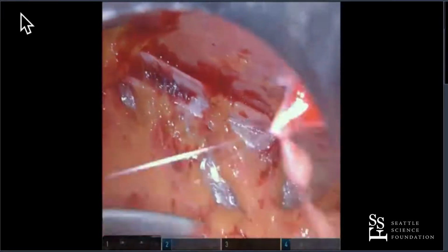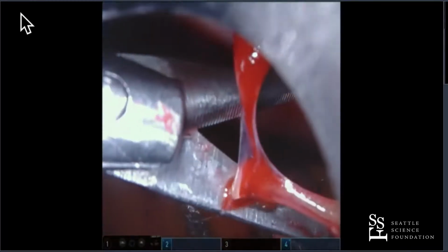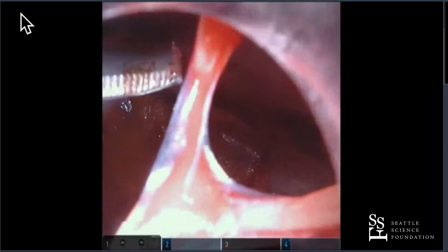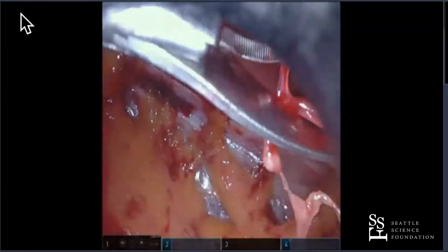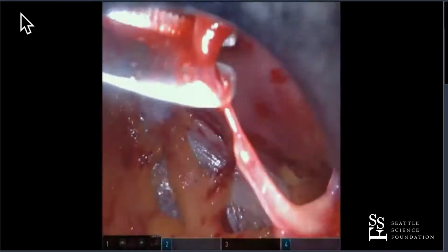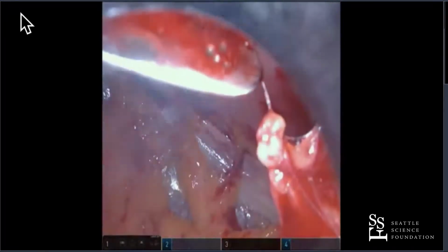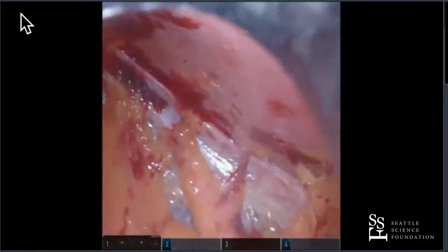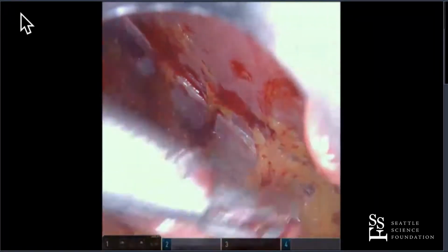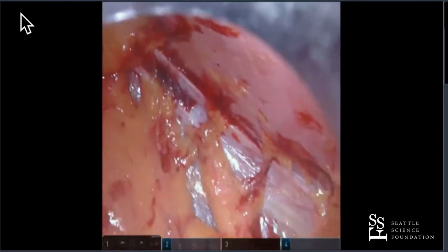Okay, all right, let's have the stick back. Actually, let me get that off, Brando, right there. Cautery, go ahead, best you can. I'm going to pull this back a tiny bit. Stop. Brando, let me have it a little bit. I'm going to pull back a tiny bit so we can get to that. Okay, perfect. Go ahead now. Yeah, that's it. Oh, yeah, nice. So you do have to do a little work sometimes right next to the camera. That's not a problem. Okay, let's have the stick back.